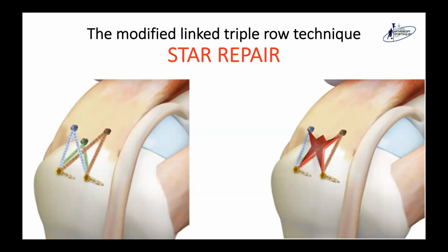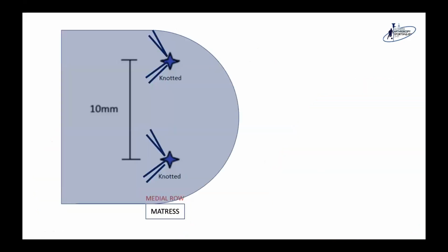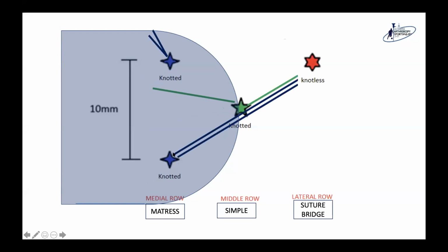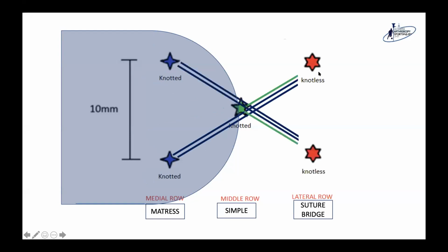Our modification of this triple row is called the modified link triple row technique, the star repair. Here, I described linking the double row to the two knotless anchors to make a star configuration of the construct. So we applied firstly the two medial anchors, passing the sutures in a mattress fashion. Then the middle anchor, where I applied only one suture color, as a simple suture. And then finally the suture bridge using the sutures from the medial and middle together into the lateral knotless anchor in this configuration to end with this star repair construct.